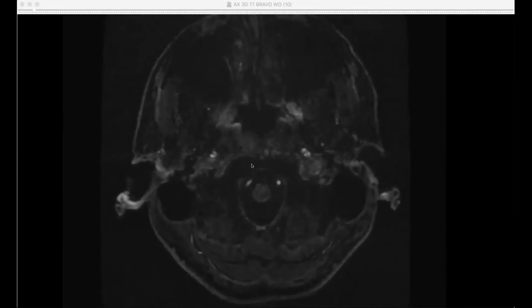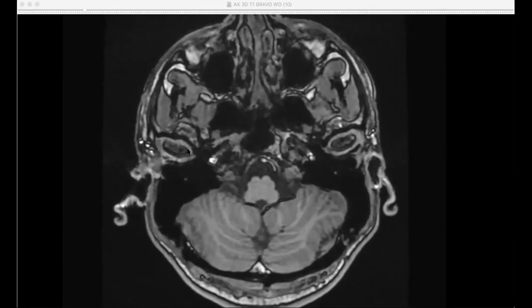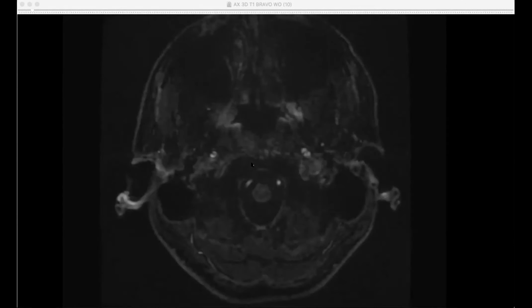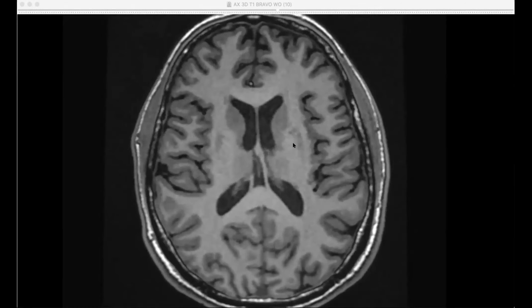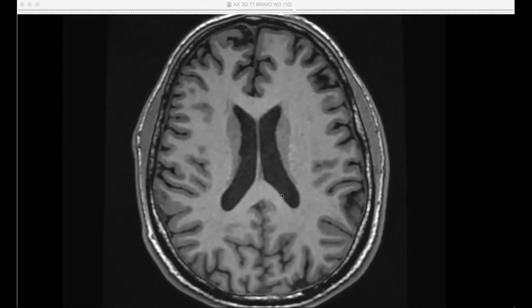Why is that the only one that you see? It's not the only one, actually. 1, 2, 3, 4, like these carotids, actually. See the carotid? Now you can track them, yeah. These two. Okay. Let's see what else we can see in this image. CSF, it's made out of pretty much free water. So yeah, very dark in T1. Okay.